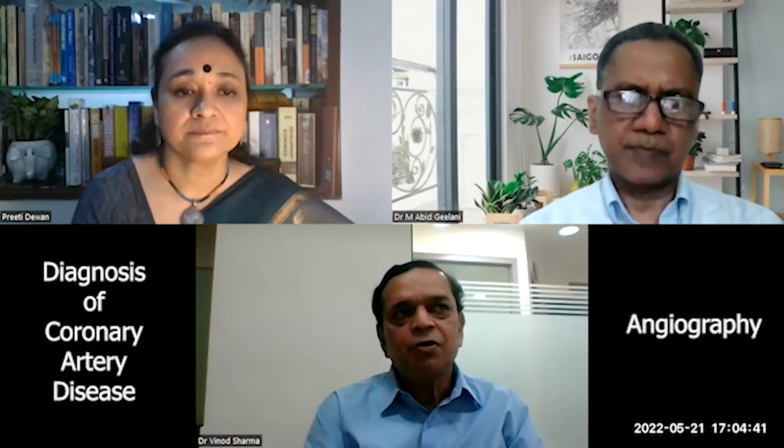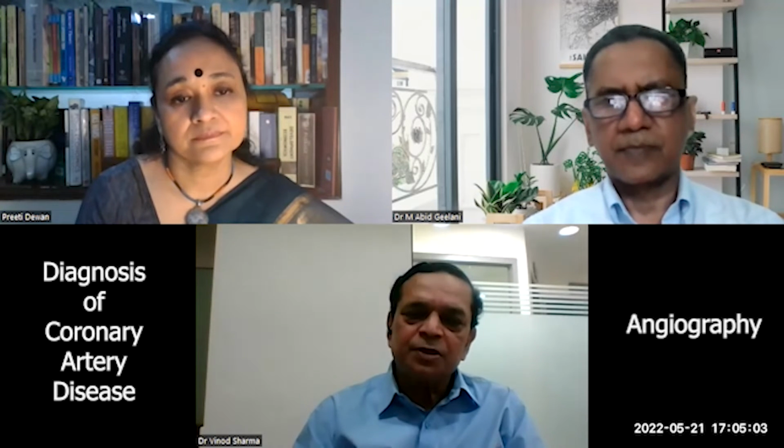Right. Now, CT coronary angiography is there. Yes, it is to be utilized for screening purposes in people in whom the probability of coronary artery disease is low or intermediate, or whenever we want to screen a high risk population which is not symptomatic. Then one can have a CT coronary angiography. But for those people in whom symptoms are very suggestive and ECG changes are there, it is good to have conventional coronary angiography to define the extent and severity of disease and to decide the modality of treatment, whether we leave them on medical treatment or percutaneous intervention or surgical revascularization.